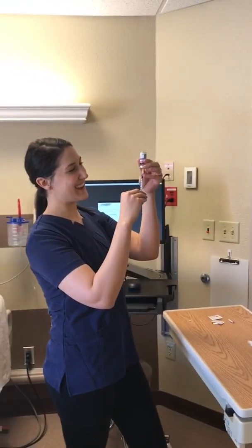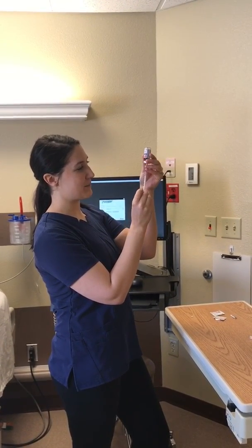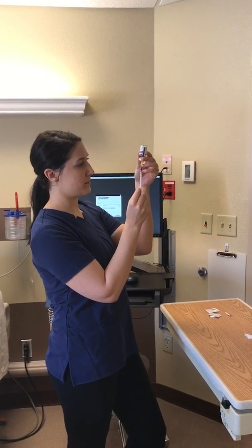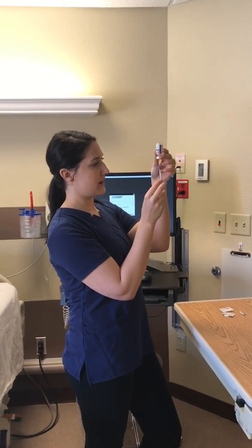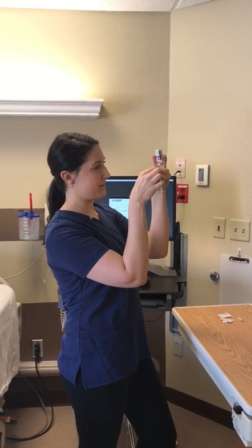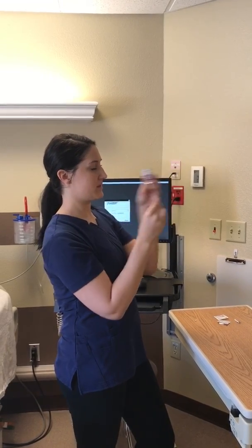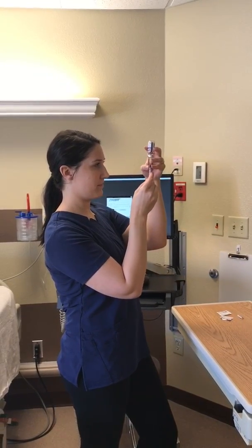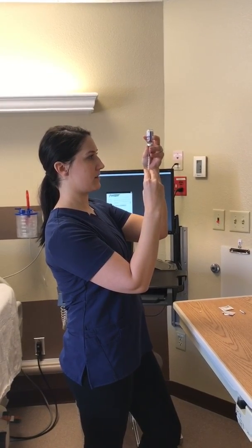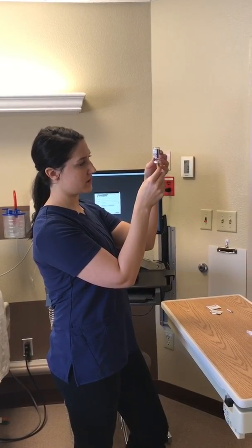And I'm going to inject that air into the vial, and then stabilizing it, I'm going to withdraw 0.1 mils, and I'm going to go ahead and tap that, get those bubbles out. I'm going to swirl it. Perfect. Okay, so I have 0.1 mils drawn up.